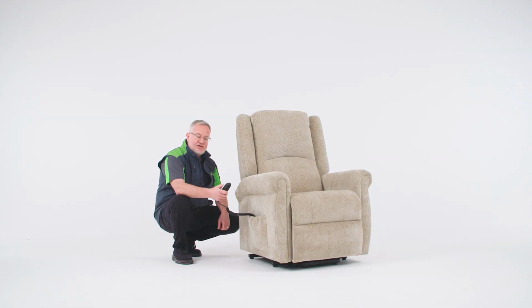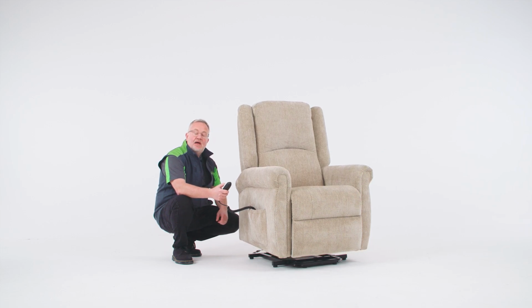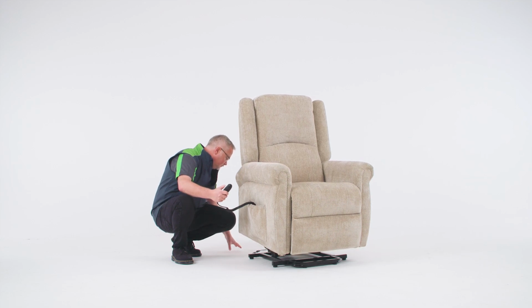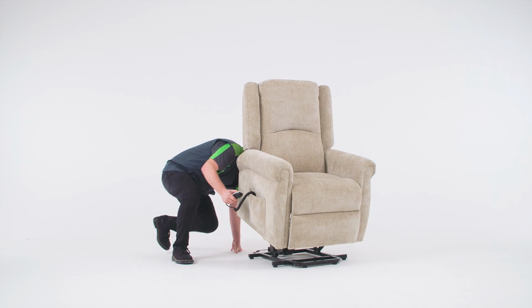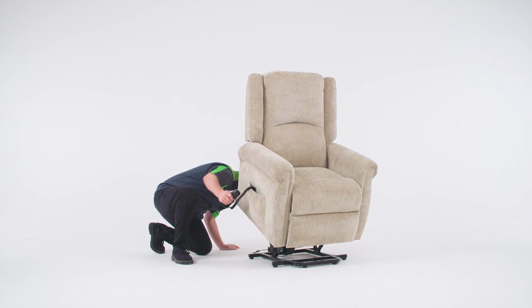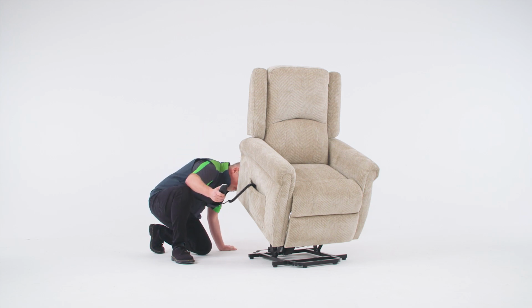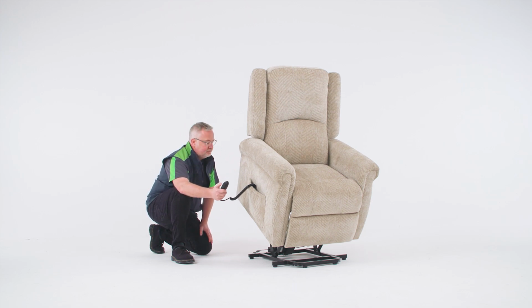I'm going to start by raising the chair, and as I do so, I'm just going to stop and check that none of the wires are catching on the framework. I can now carry on. And as you can see, I'm just checking that nothing's going to catch. With that complete, I'm going to bring the chair back down.